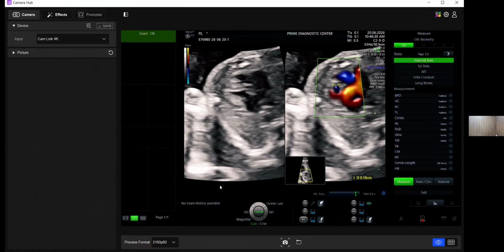So today was a lucky day to begin. I hunted for something and it was there. And now you know how to hunt and how to see when it's there. We would put an M mode also on that and show you. But I don't recommend that you should be doing M mode.